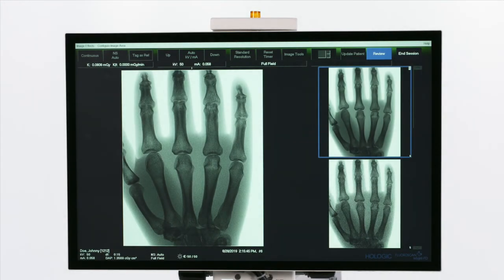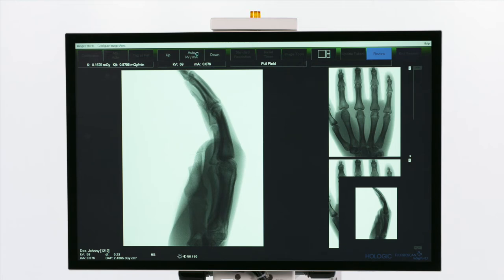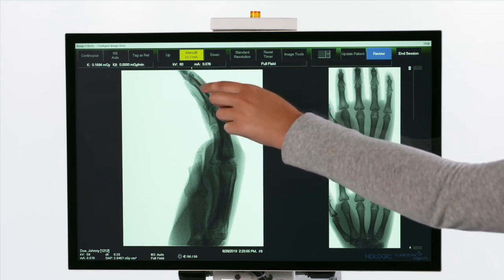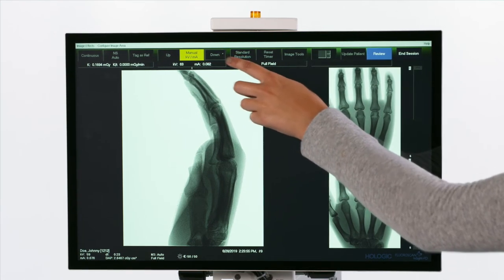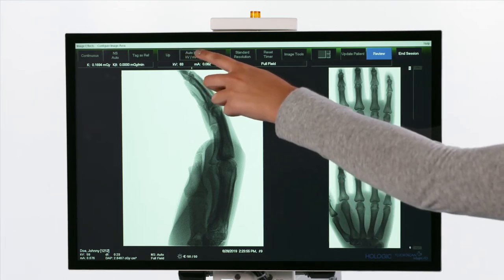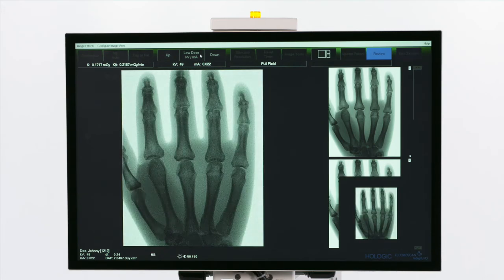Auto mode automatically adjusts the kilovolts and/or milliamps to acquire an enhanced image. Manual kilovolts and/or milliamps allows the user to manually increase or decrease the kilovolts and/or milliamps. Low dose automatically adjusts the kilovolts and/or milliamps to decrease the dose to the patient by up to 50% compared to auto mode.